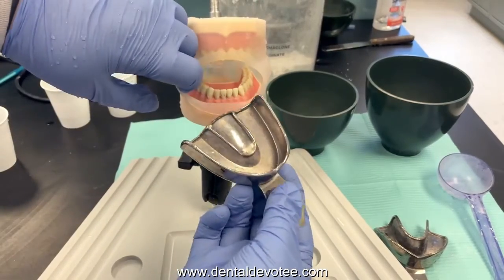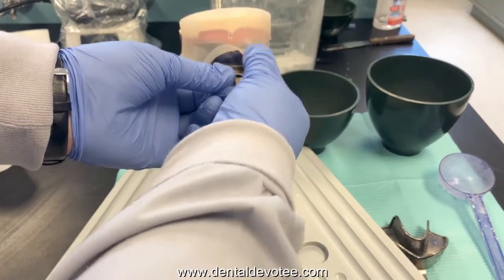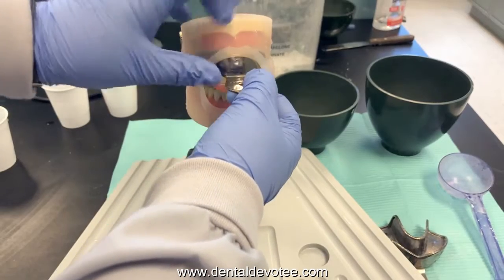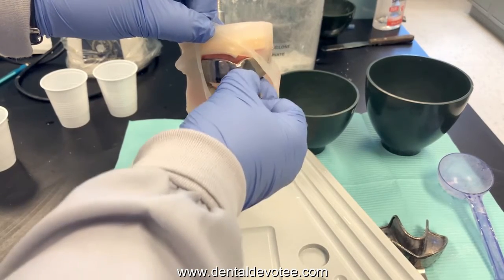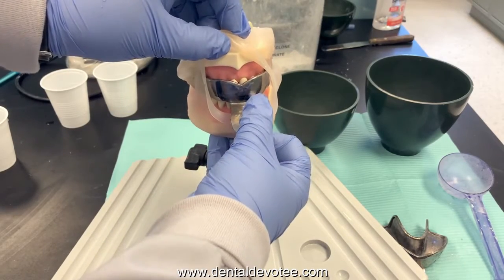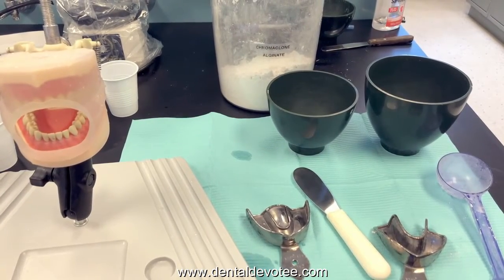Try in your maxillary tray the same way. Retract one side, insert at an angle to help stretch out the opposite cheek, seat the posterior first and then swing the anterior into position. Make sure their lips are outside of the tray. Make sure the tray extends past the tuberosity area and covers all the teeth. Also make sure — pulling their lip up here — that the tray has a buffer zone between the tray and their teeth. We don't want the tray scraping against their front teeth; we need room for the impression material to sit. Let the tray come out of the patient's mouth slightly by about a quarter of an inch. If you have a good fit, remove the tray at an angle.